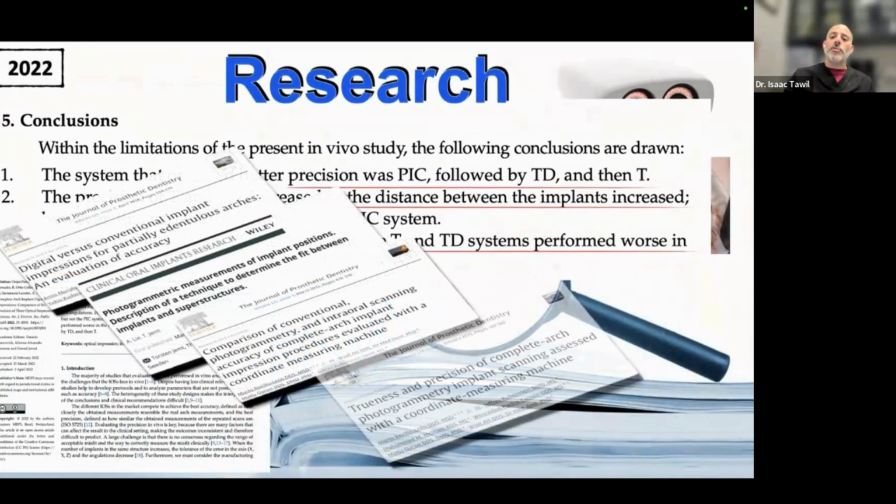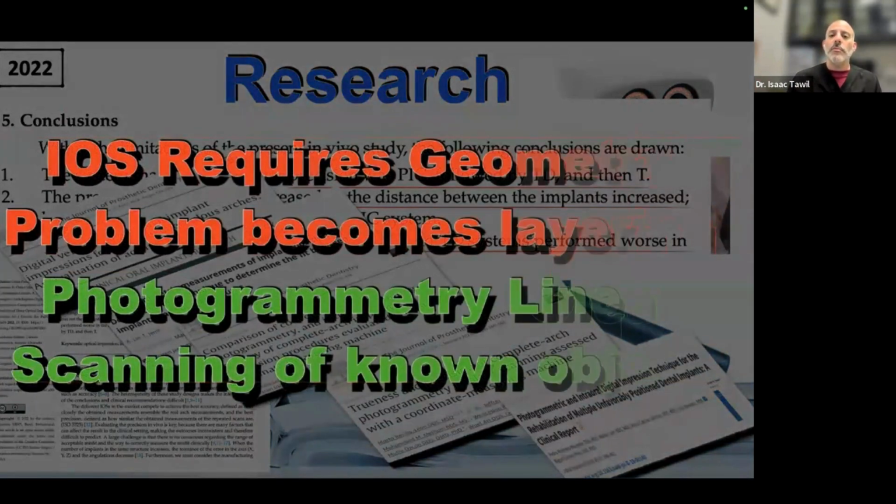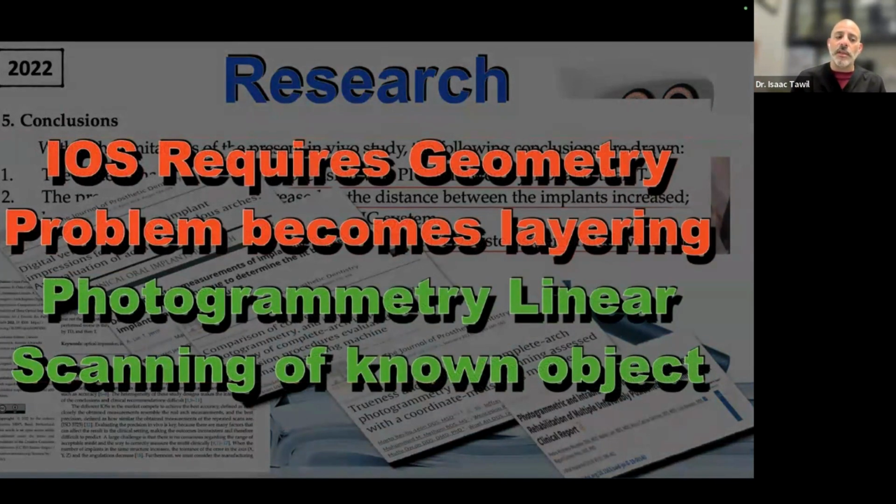Photogrammetry is superior for capturing implant position as compared to intraoral scan. And again, the reason is we remove the geometry in these cases. They're implant cases. We have no geometry. All we have is the implant positions, and we're using scan bodies that look exactly the same. So we're stitching one on top of the other, and we're trying to align this data. And unfortunately, the stitching, as I showed, is not always perfect.